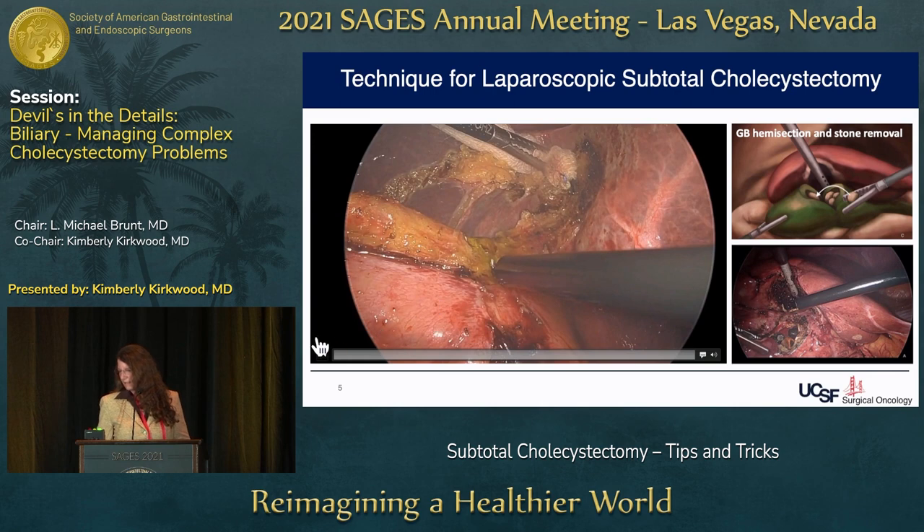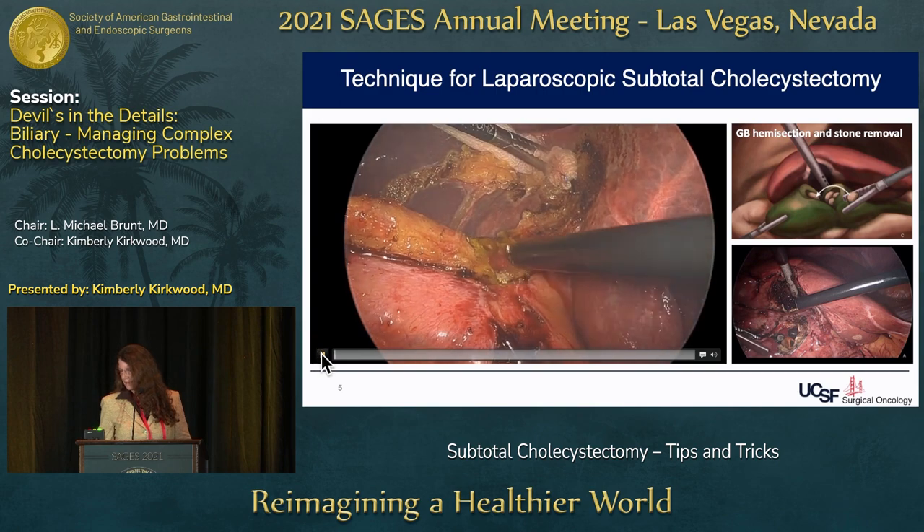About halfway down this plane, when the cystic plate starts to become thick, the proper dissection plane has moved away from the liver. If you continue using the liver as your only landmark, it will keep you too close to the liver and draw you right into the right posterior pedicle — that is the error trap and why people hesitate to recommend fundus-first, because you can end up transecting the right portal vein. The pivot here is to move back into the gallbladder and intentionally enter it to avoid that error trap.